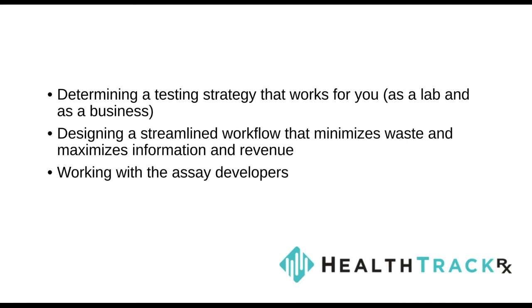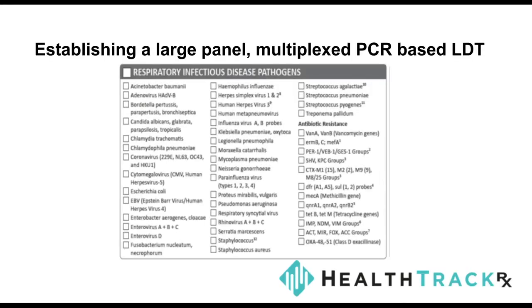And again, I'll be bringing up this point again and again, as you begin to think about developing these strategies, these workflows, or bringing these tests on board, you would want to work very closely with your assay manufacturer or your test developers. So what was our approach when we looked at the whole workflow?